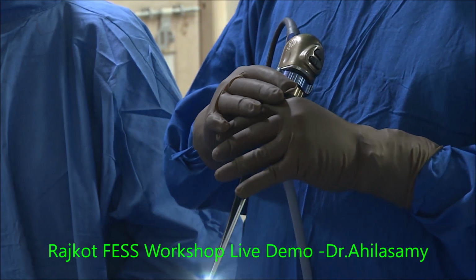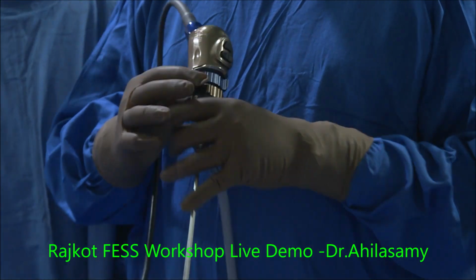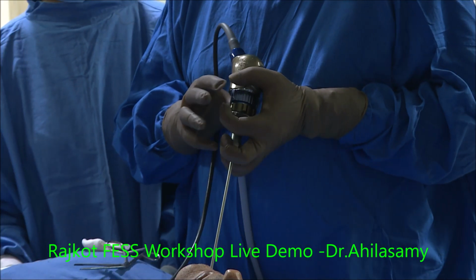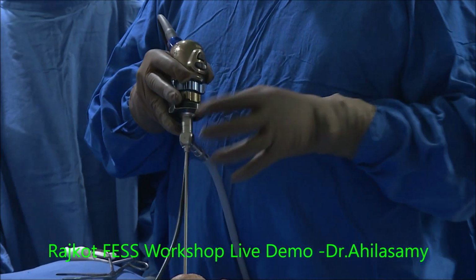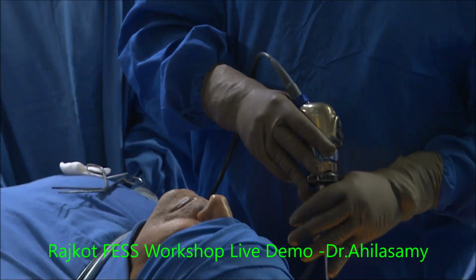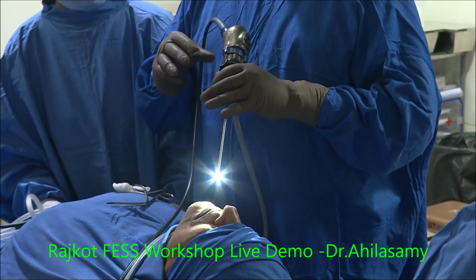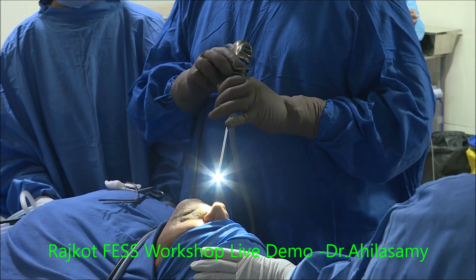So this is my way. You follow whatever you like. This is my way of teaching. I don't touch it here. Some touch like this, so they get a pain here. It all depends. But this is my way, and my good friend Dr. Jani Ram also teaches this way. Okay, it's lovely. Now endoscopic picture, please.